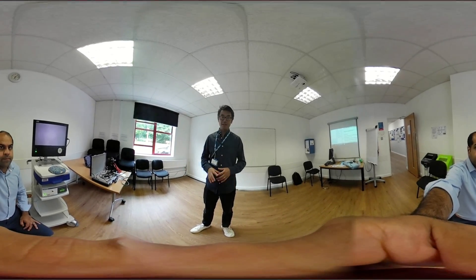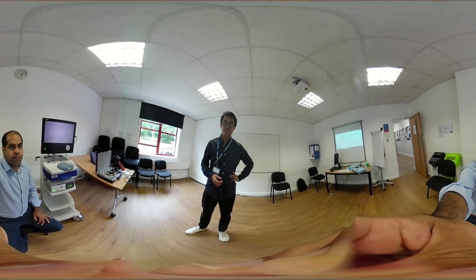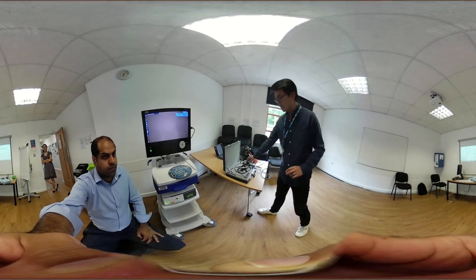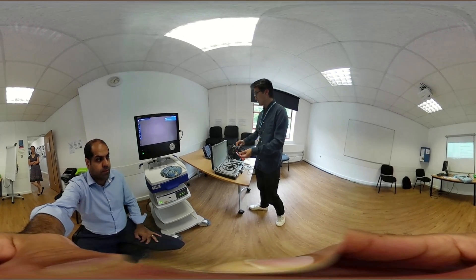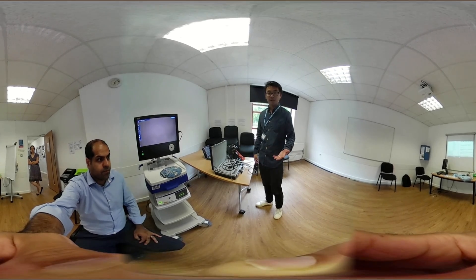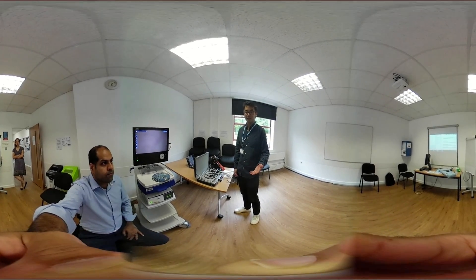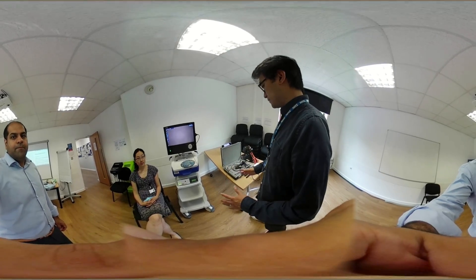Now that you've got all the equipment by the bedside, explain to the patient what you're going to do — that you're using a small camera through the nose to look at the back of the nose, down the throat, and all the way down towards the voice box. Show them the tip of the camera and explain that not the entire fibre optic camera is going in — only about half of it is needed. Explain that it takes between 20 and 30 seconds, it can be slightly uncomfortable but shouldn't be painful, and they should let you know if it does become painful. It may bring a tear to the eye, but that's entirely expected.